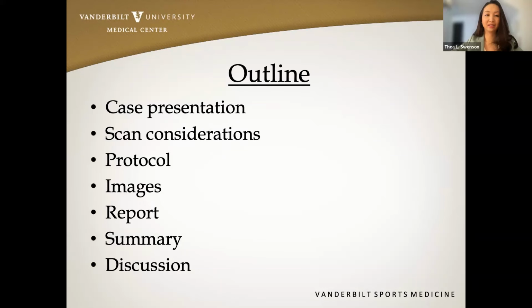The emphasis of this talk will really be on scan considerations and protocol for ultrasound examination of the anterior knee with a specific focus in the pediatric population. I know, at least in my experience, that I see a lot of adult patients in the clinics that I've worked in, but this will be a comprehensive ultrasound exam for pediatric knee conditions.